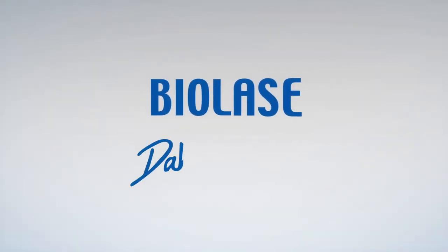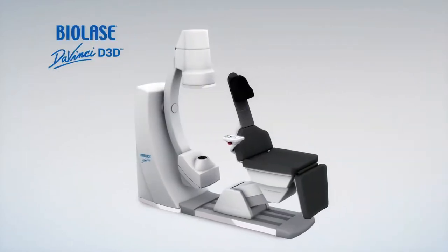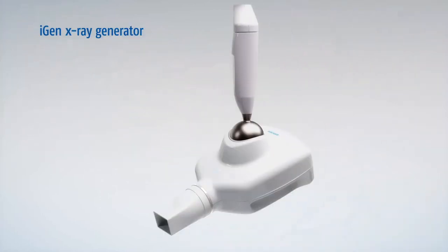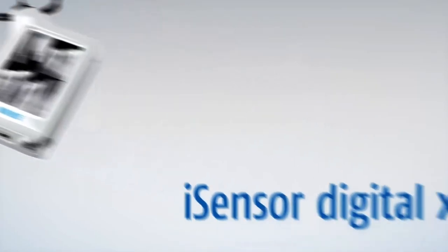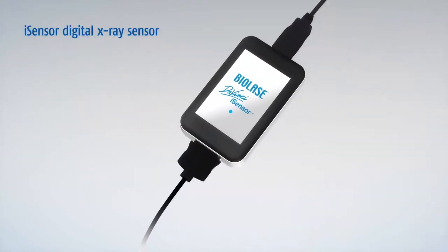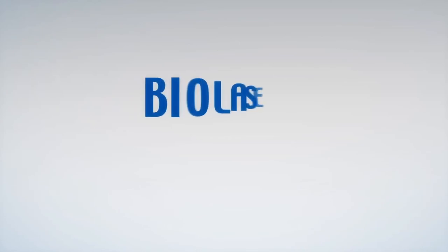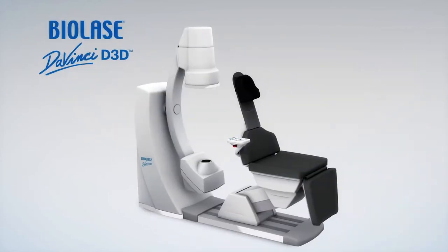The D3D is just one of the many BioLase DaVinci Imaging products designed to help you diagnose efficiently and comfortably, including the iGen X-ray Generator, iTab Handheld X-ray Viewer, iSensor Digital X-ray Sensor, and iView Intraoral Camera. The BioLase DaVinci Imaging D3D is one of the lowest-dose cone beam systems available.